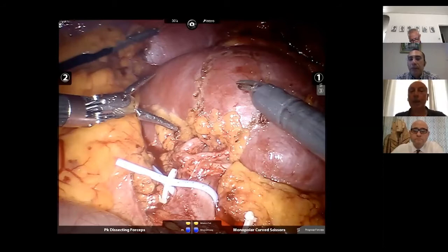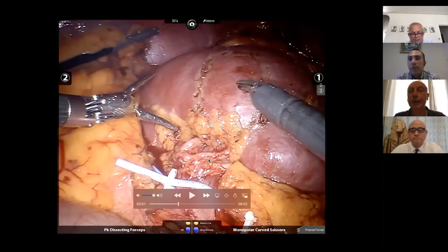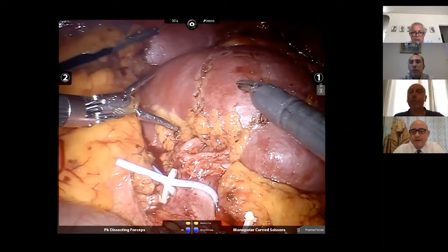And so I think that we have many advantages. At this moment, we did a comparative study in which we show clearly that there are no advantages if we use ultrasound. If we have augmented reality, we can avoid the use of ultrasound. And moreover, augmented reality overcomes the utility of ultrasound, because augmented reality shows more advantages in other steps.